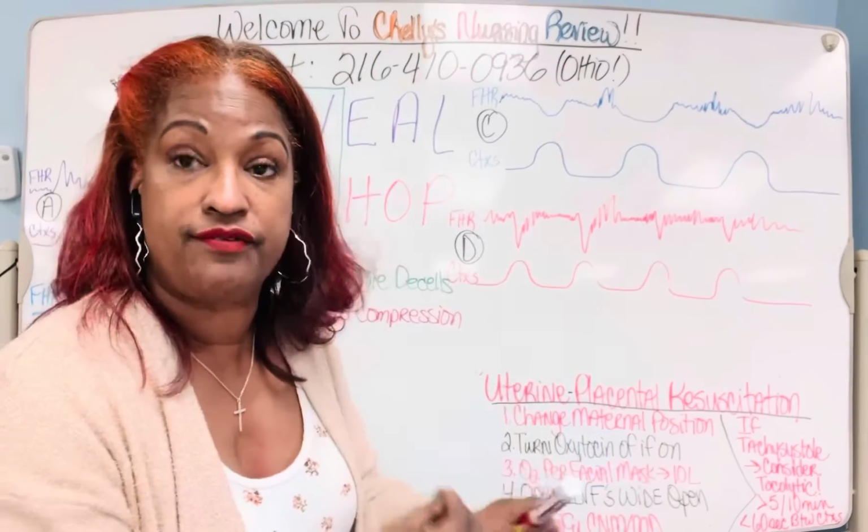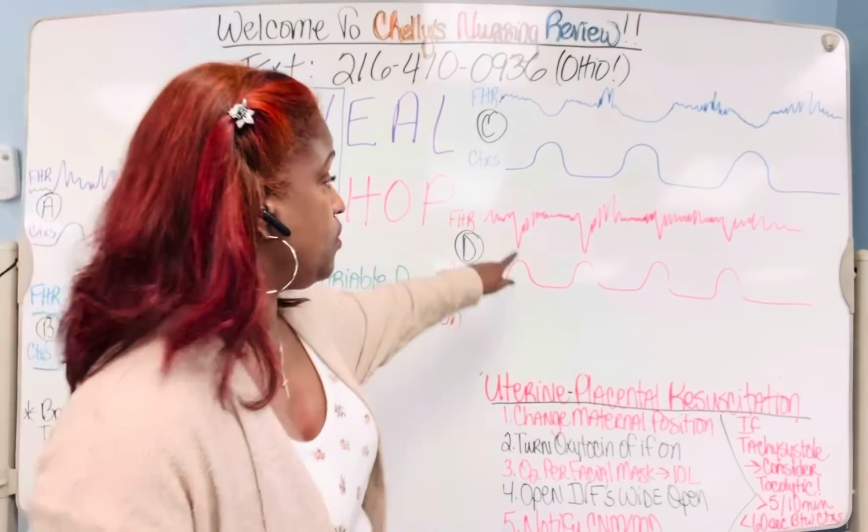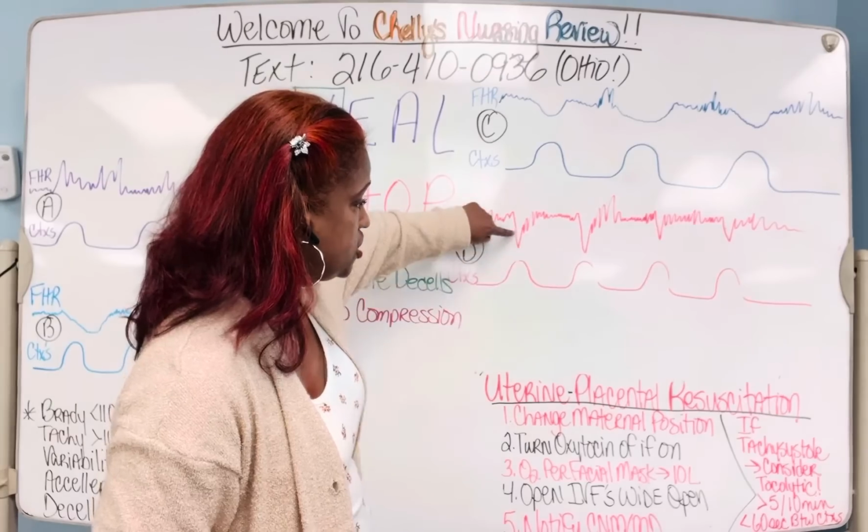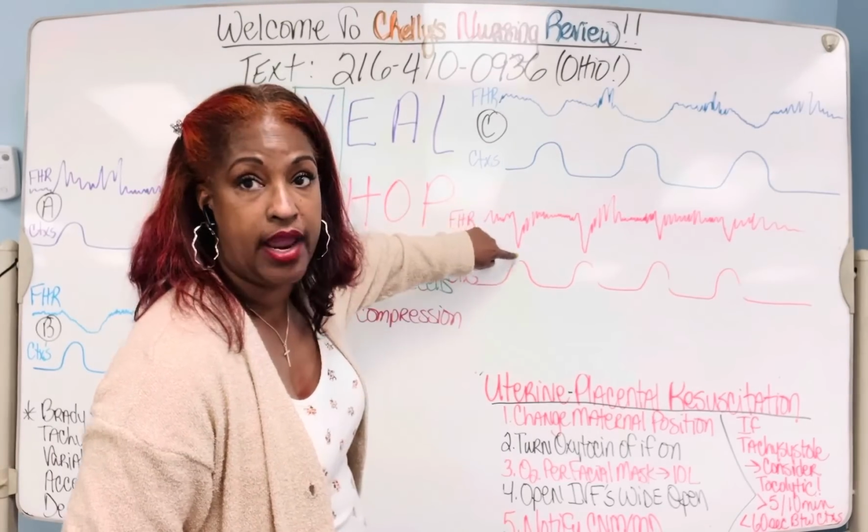In other words, these two kind of go together. The top of the contraction is the lowest part of the heart rate.